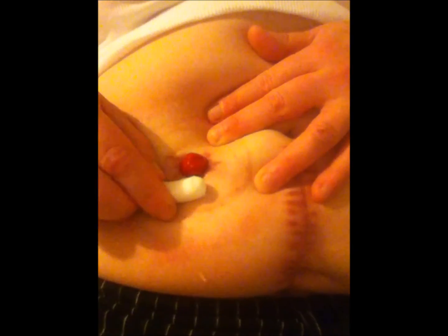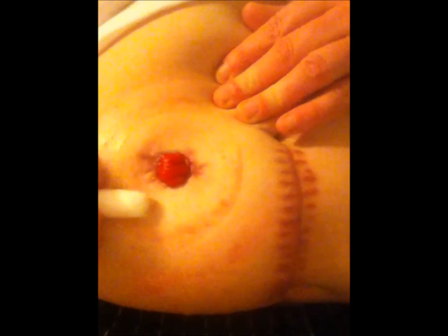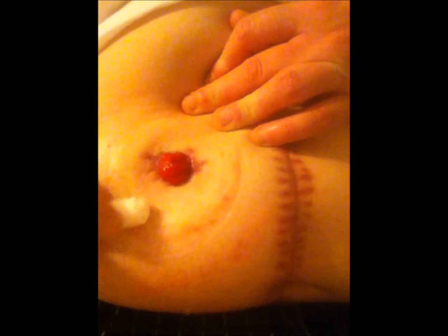Now this is a very healthy looking ostomy. My ostomy kind of sticks out of my belly a little bit, so that's why I use the ostomy belt. But don't let it alarm you that this is red, because it's supposed to be red. If it's not red, that's when you should be alarmed. Sometimes when I clean it, it bleeds, but it doesn't hurt, and that's normal. It's actually a live organ, and it really doesn't have any feeling.